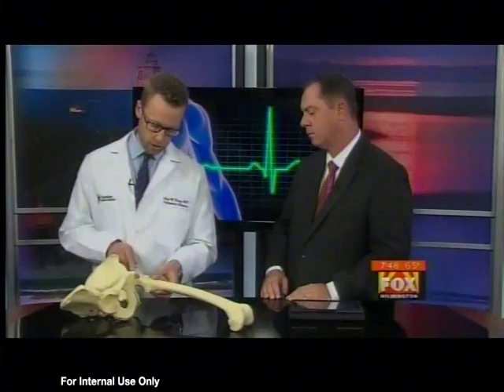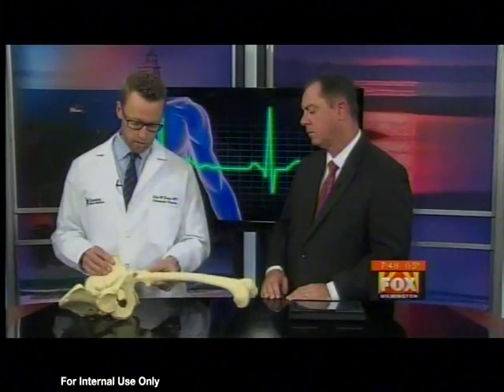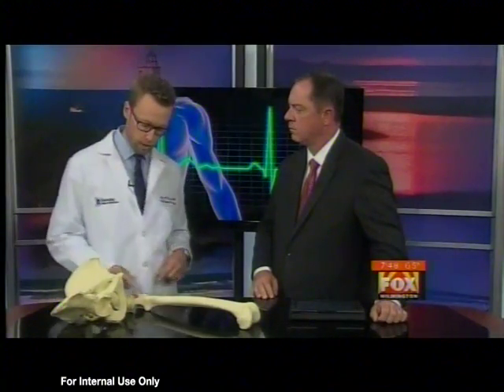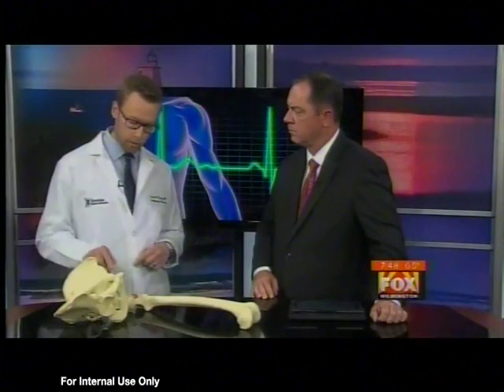And the 2 common things that we treat are hip impingement or labral pathology, which is what people have probably heard of. And on this model here, I put together some clay, a little bump on the femoral neck, and as you flex the hip and internally rotate, sometimes that bumps into this labral tissue here, and that can lead to tearing of the labrum and damage to the articular cartilage inside. And so if we can get to that early enough, we can get in with the scope, we can shave off this bump and shave off some of the extra bone on the cup side and repair the labrum and hopefully prevent the onset of arthritis.